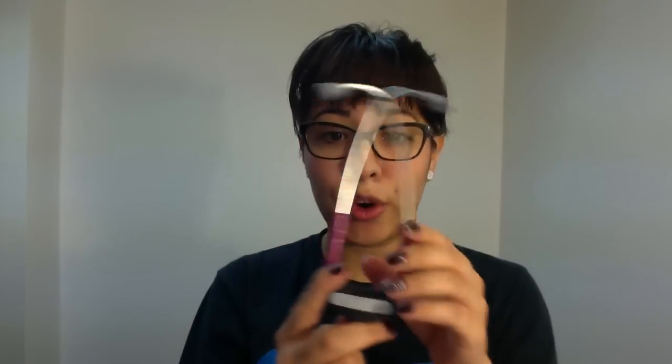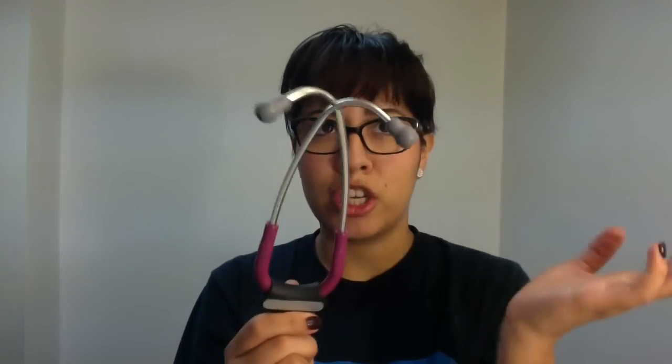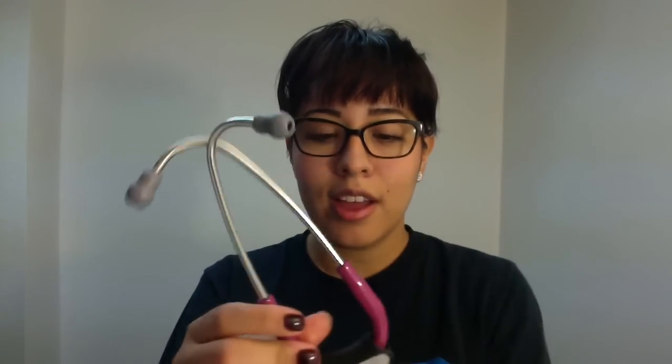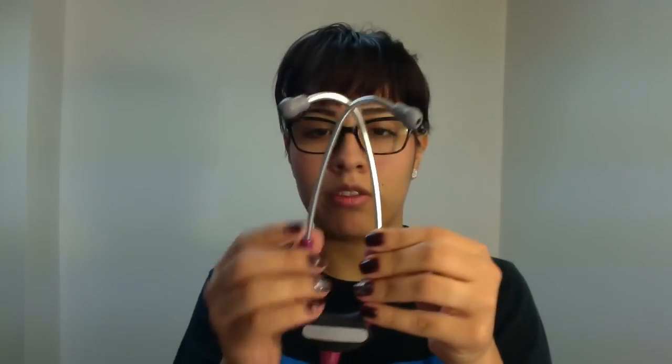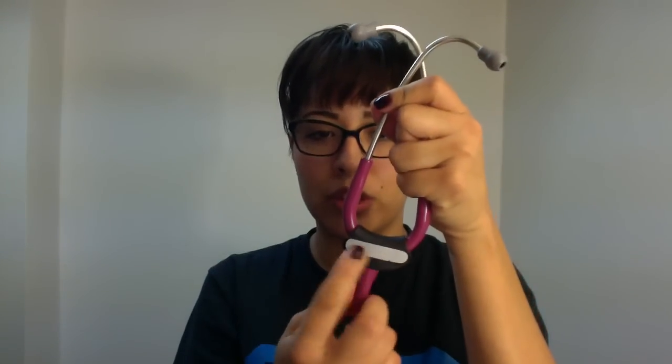It's only about $7, maybe less or possibly more now. When I bought this stethoscope it was about 4 years ago so it might have been cheaper then. I use this as my guide to remind myself that I want people to see my name, and so I need to put it this way. That's how I think about the correct orientation.